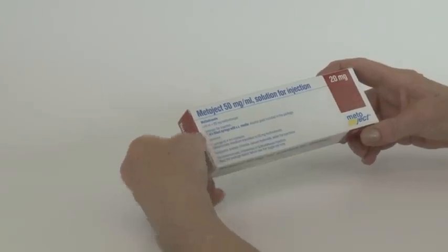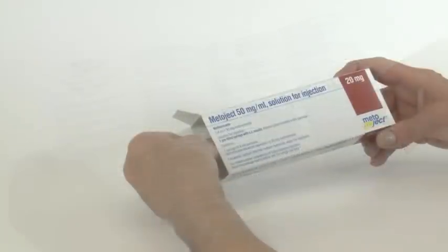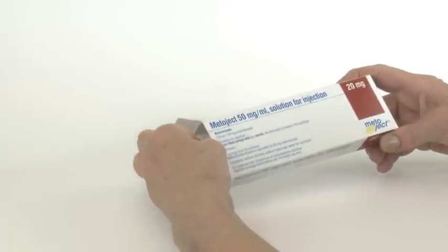Open the carton, remove the patient information leaflet and read it carefully. Remove the inner plastic container from the carton. The syringes are all color coded for each individual dose. The colored backstop on the syringe corresponds to the color on your carton.